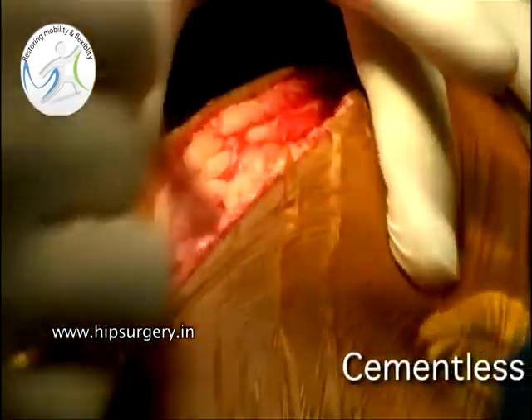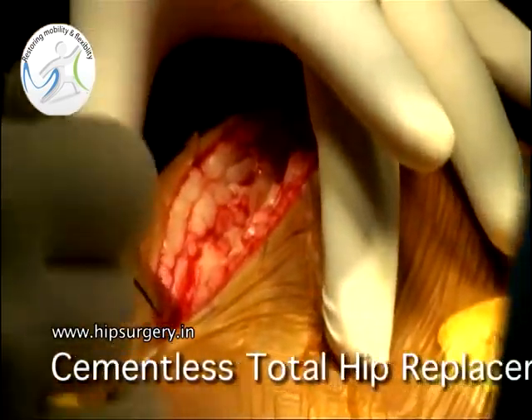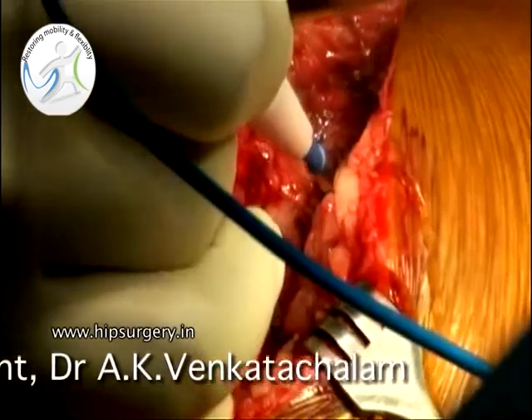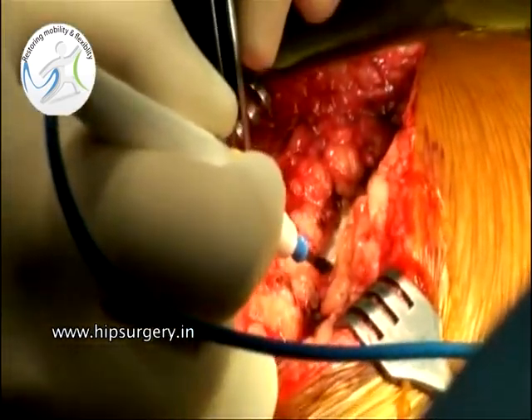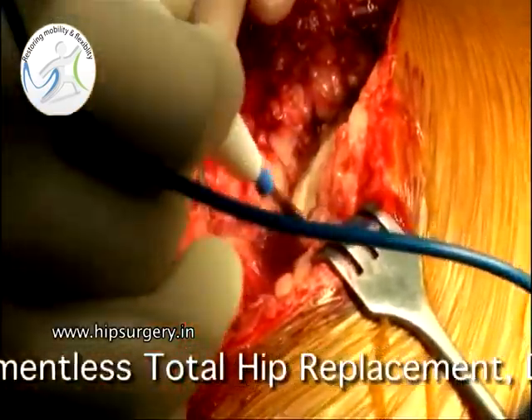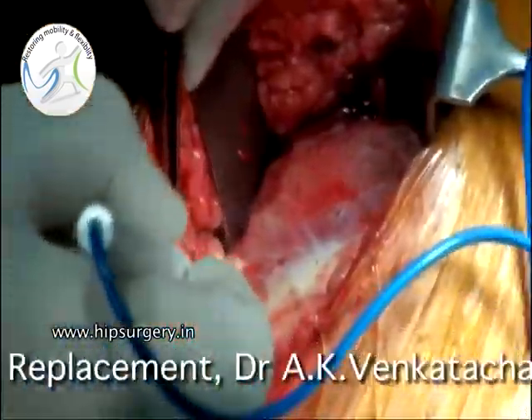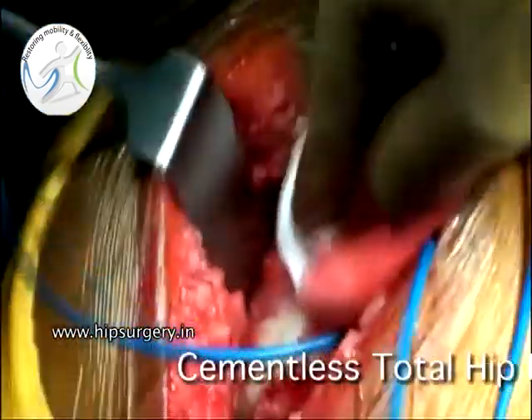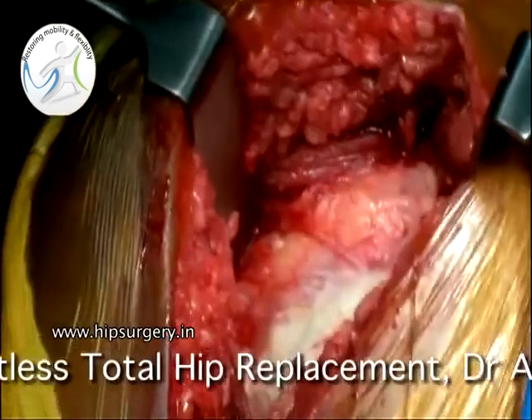The patient has been positioned in the lateral position and the hip is approached through a posterior approach, which is centered over the greater trochanter. The short external rotators and the capsule are divided in one layer.